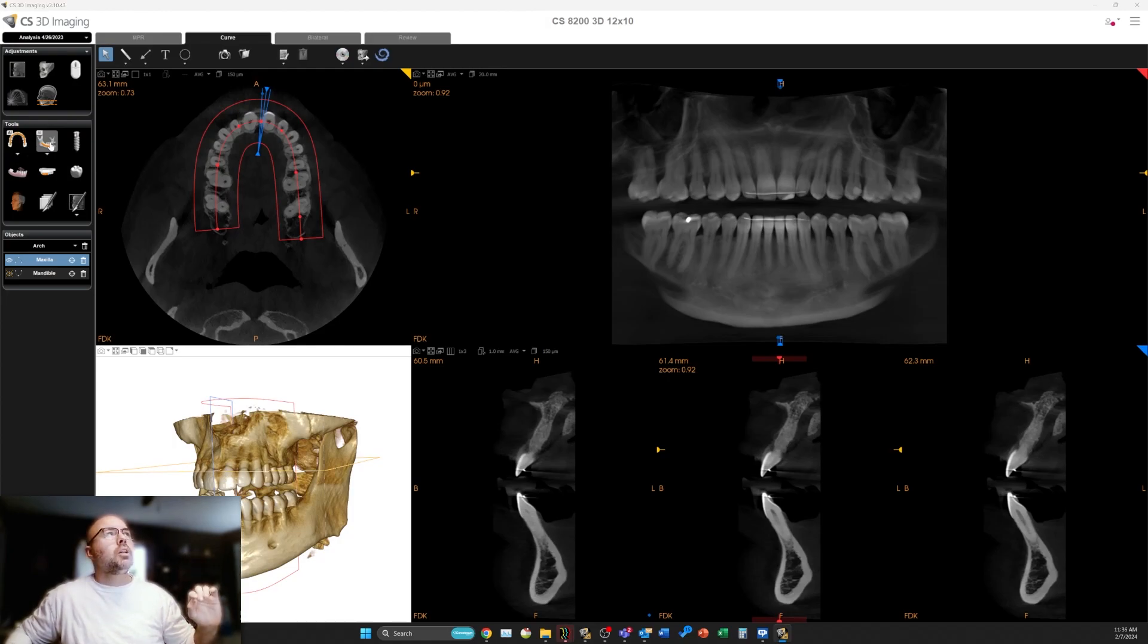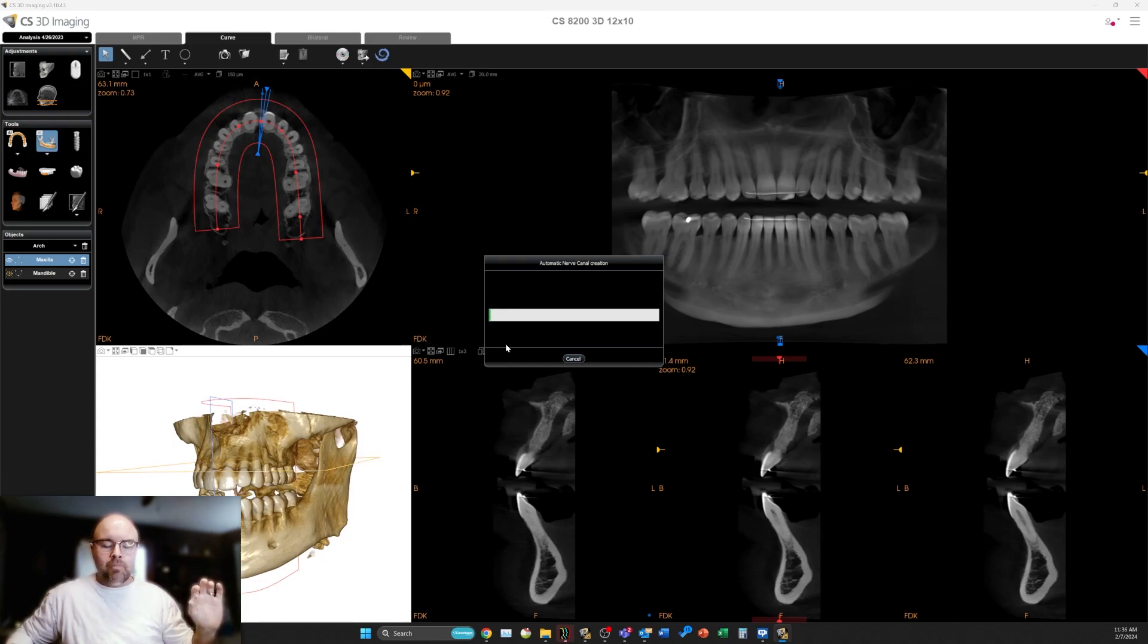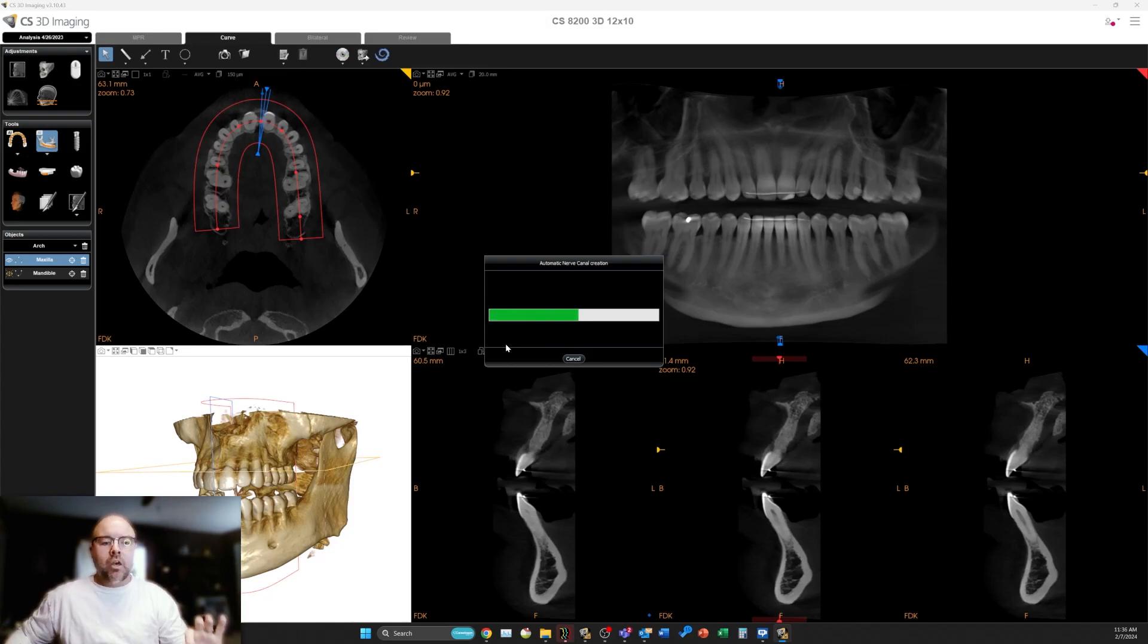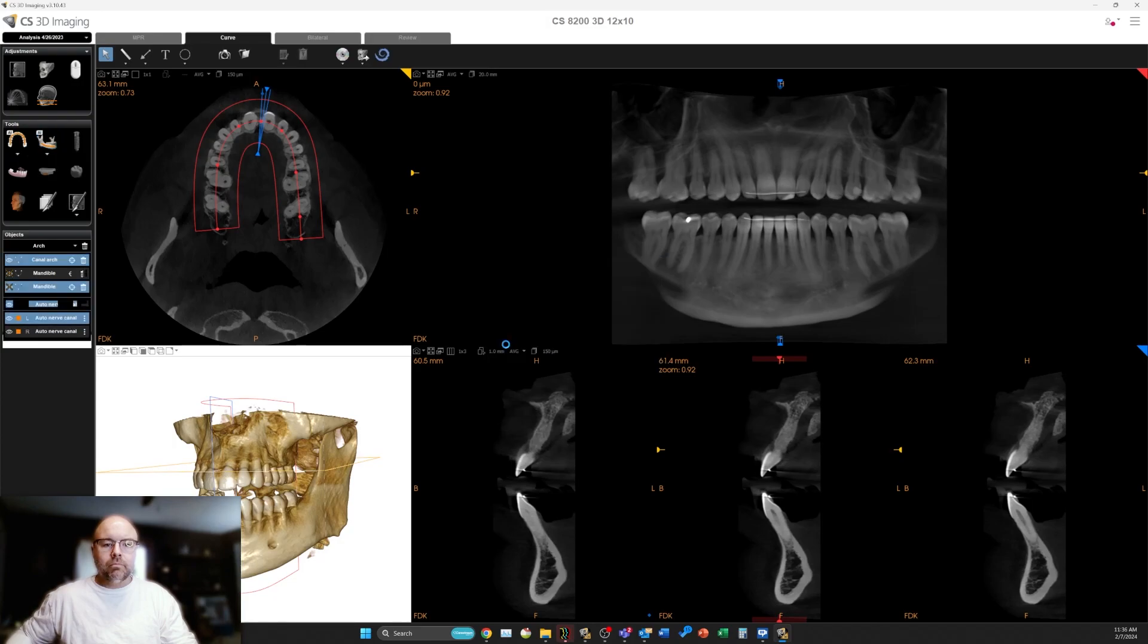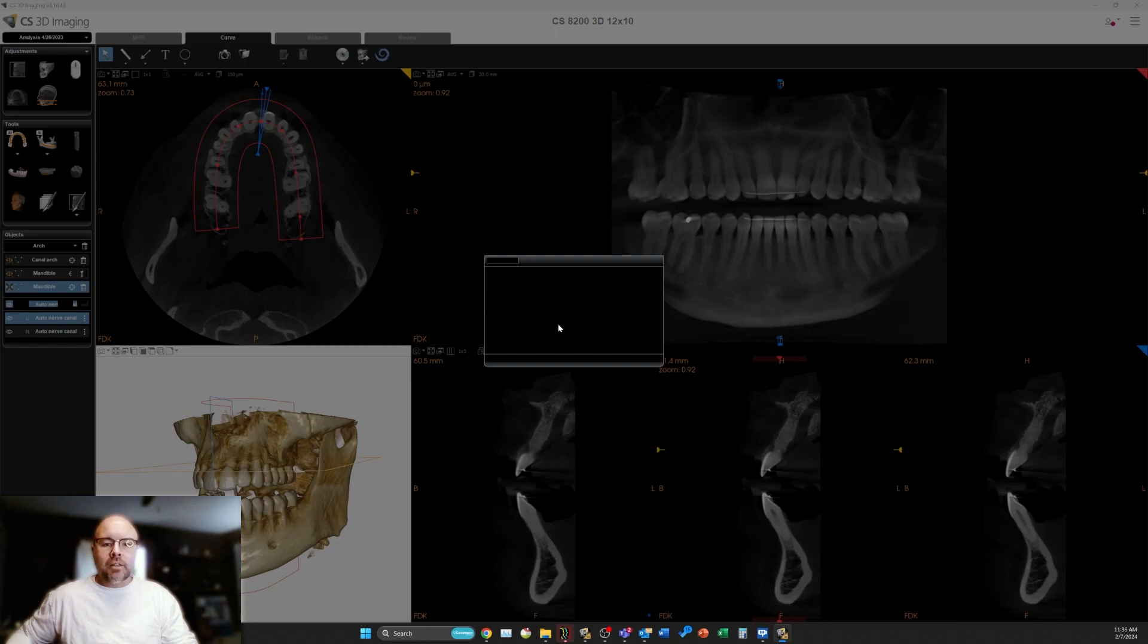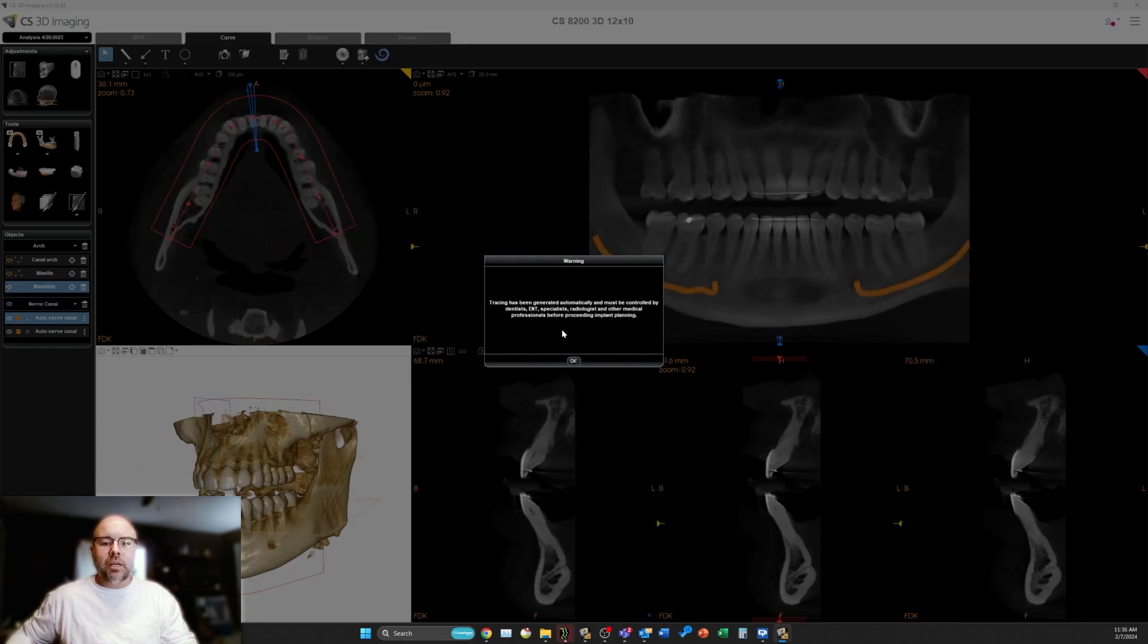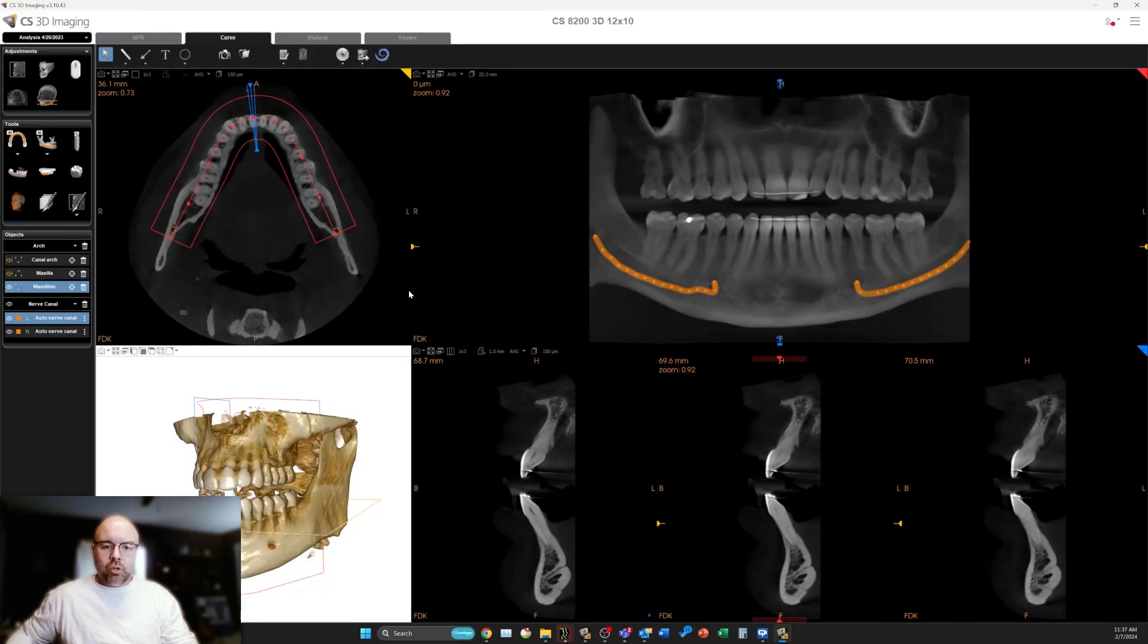Let's see how this works. I'm going to click on auto create arch, and we get another progress box here. Again, this is all in real time, so you're going to see just how quickly this works. Once it's done, we should see this switch right back over to the mandibular arch. We get a dialogue box here letting us know that we need to be a little discerning about the information that was created.